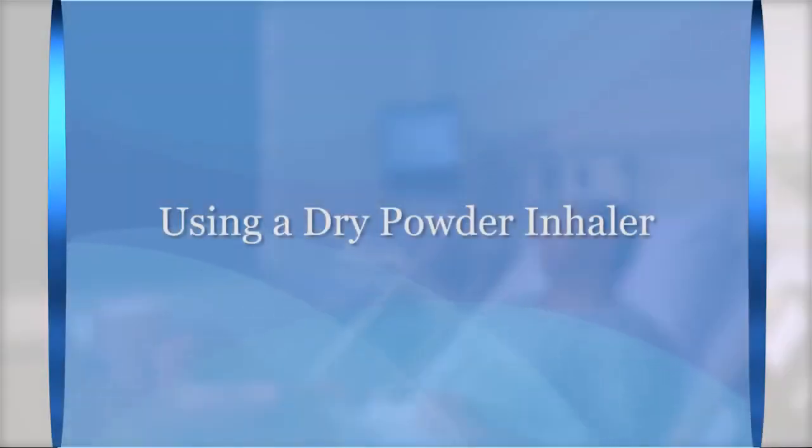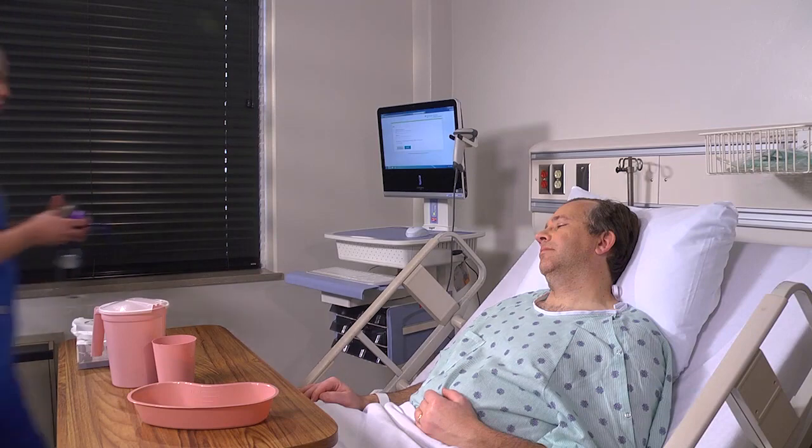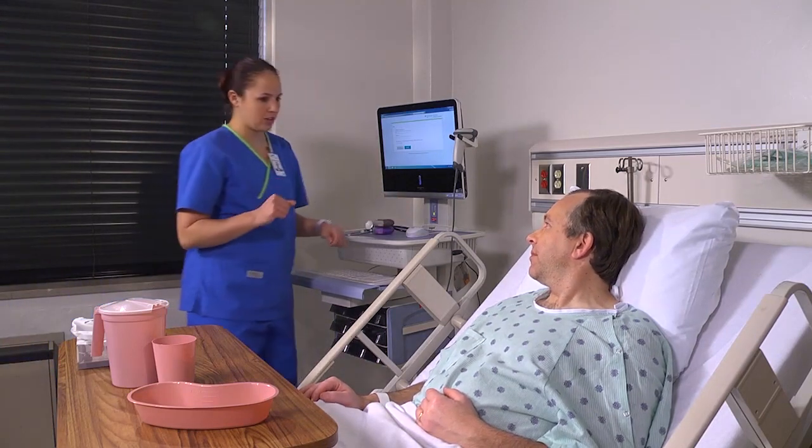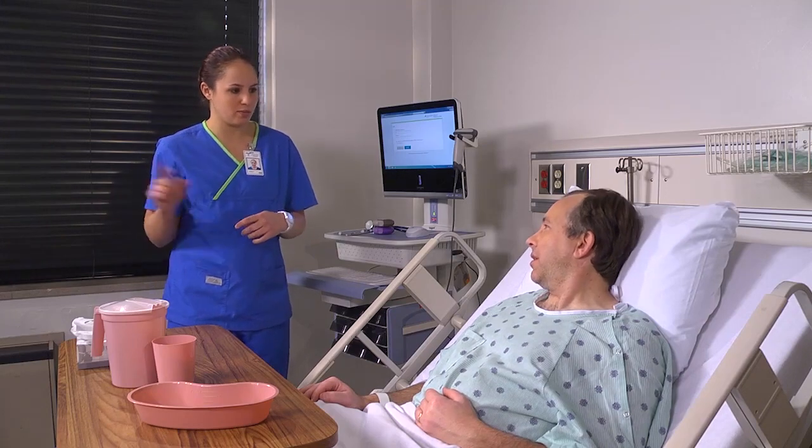A patient using a dry powder inhaler for the first time will need to be instructed in its safe use. Introduce yourself to the patient. My name is Jessica. I'm going to be your nurse today, okay? I'm just going to wash my hands. All right.